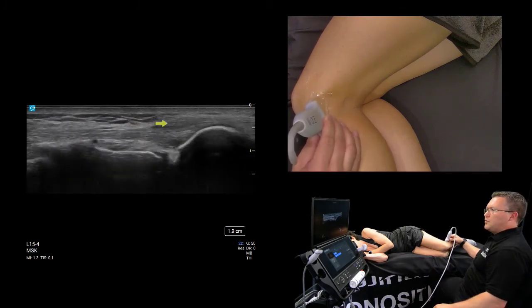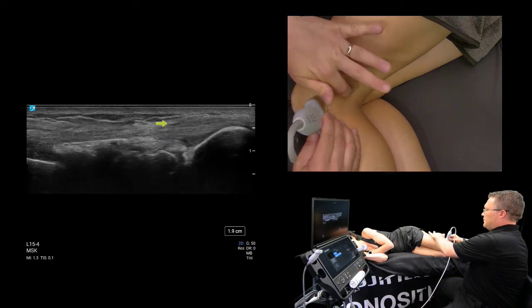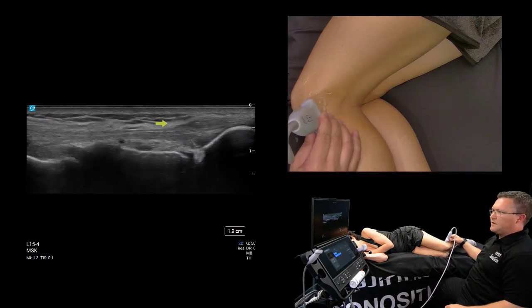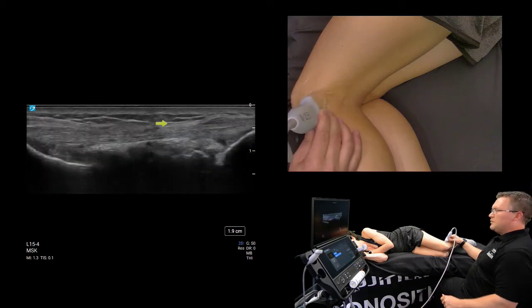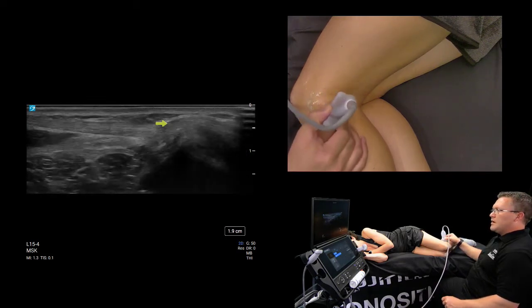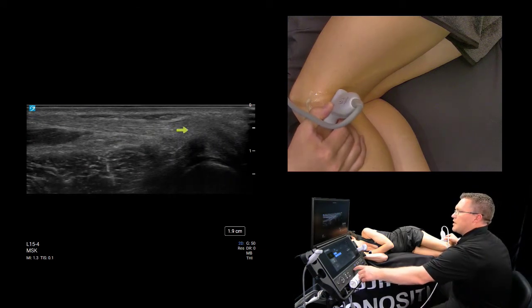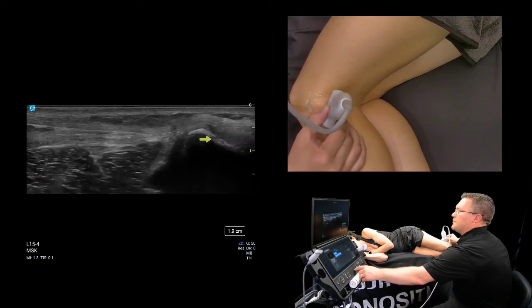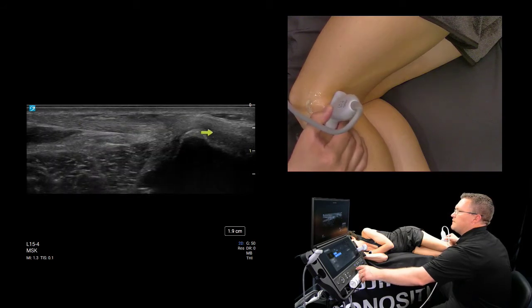And to prove that, what we're going to do now is just plant the probe on the fibula, and I can palpate her biceps femoris just fine. It's probably not that way for everybody that needs an ultrasound, right? So I'm just going to swing the proximal side of the probe posteriorly, and we're going to elongate that biceps femoris. So here we can see the biceps femoris confirming that shadow here. So here's our proximal tibia. And then here's our superficial fibula. And then there we're elongating the fibers of the biceps femoris. So just a pitfall to watch out for.